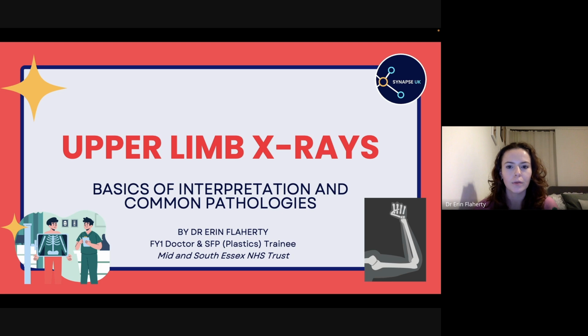So yeah, we're going to be talking about upper limb X-rays. I'm an FY1 doctor at the moment, and my last rotation was trauma and orthopedics. So I saw my fair share of good-looking upper limb X-rays whilst I was there. So we can go through the basics of them today and the common pathologies you might see when you're working.